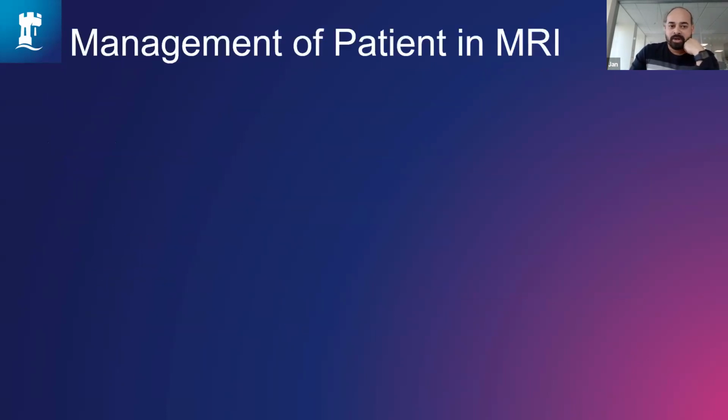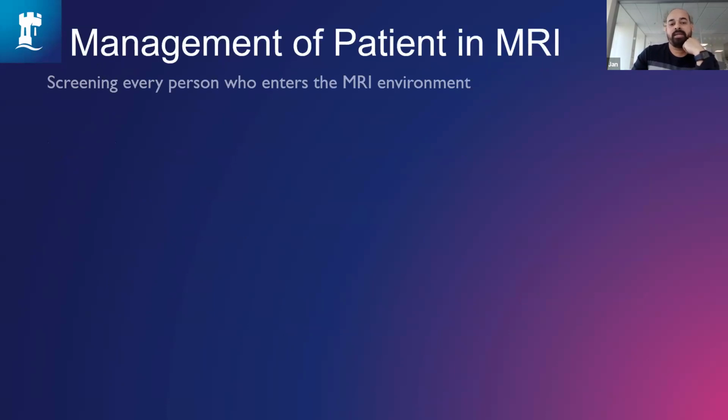Now, management of patients in MRI. Screening of any person who enters the MR environment is a must. You should have all the details, make sure that you know what surgeries they've had, what they've been through, like if they have had issues of metal bits in their eyes at any time. Knowing the history, ask them generally, chat them up to get more information out of them. Encourage them to get into the cotton gown that we provide at the hospital, or disposable scrubs that you might give, to make sure that they're not bringing anything in.